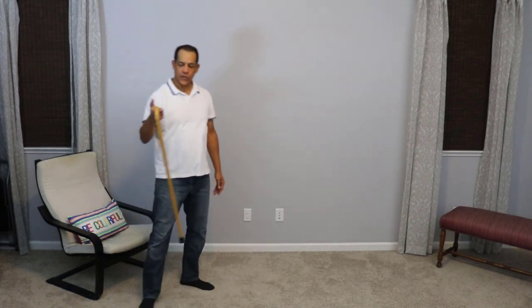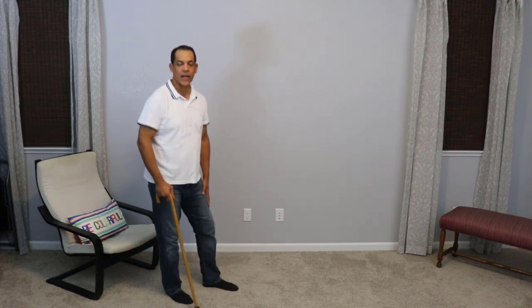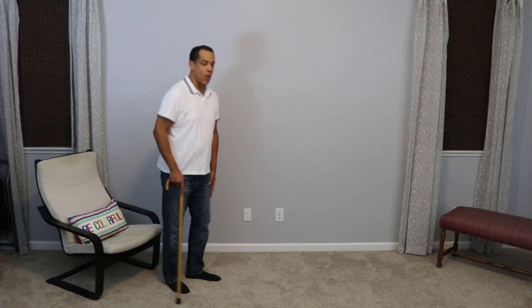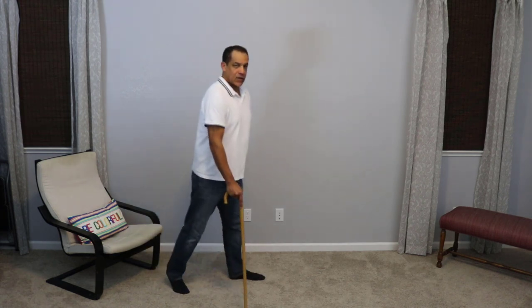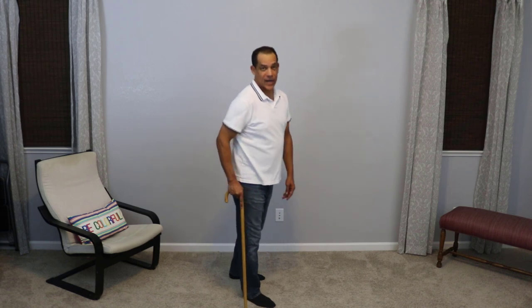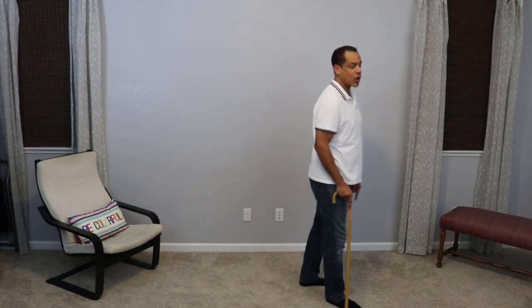So we don't want to use the cane on the same side as the bad knee. We want to use the cane on the opposite side. Assuming that my left knee is my bad knee — the one that hurts or the one that may give out — I want the cane to go out when my bad leg goes out.